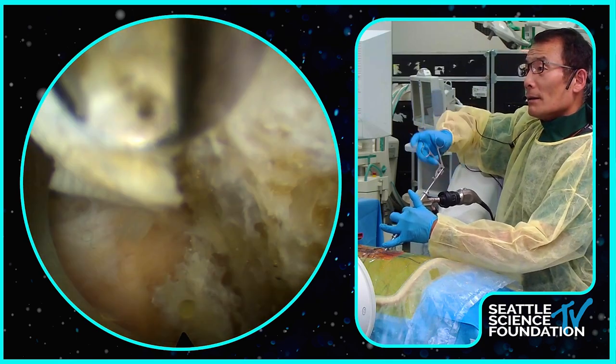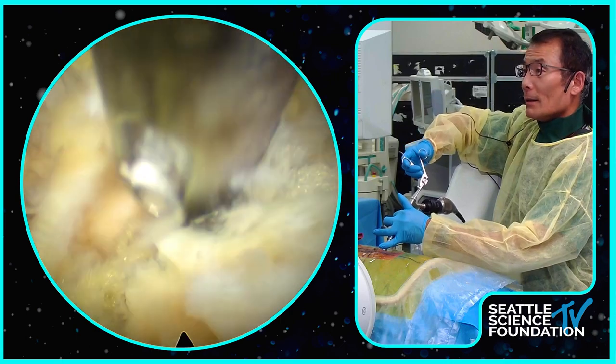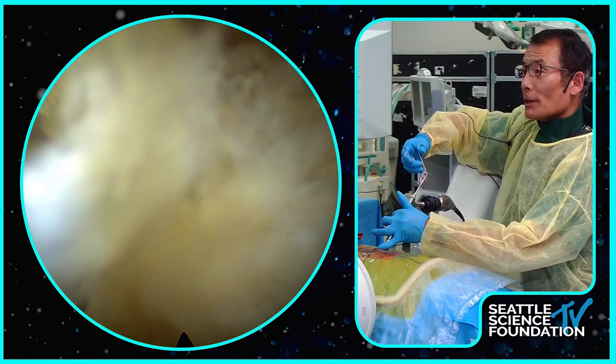See, this actually, you're looking at the contralateral. Hold on. Can I get the X-ray? I'm going to show you the thecal sac.